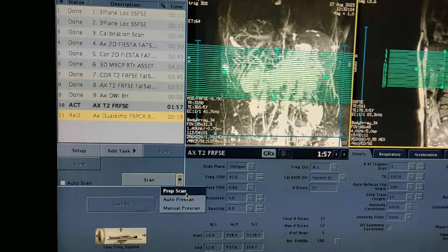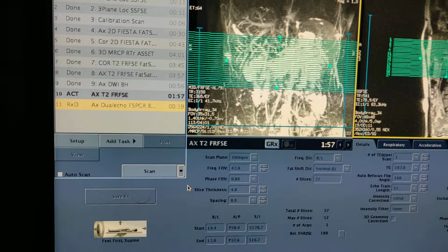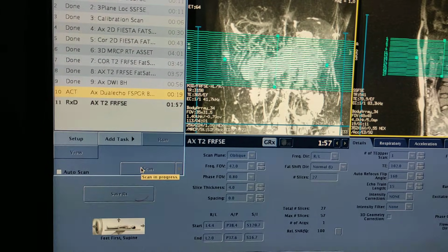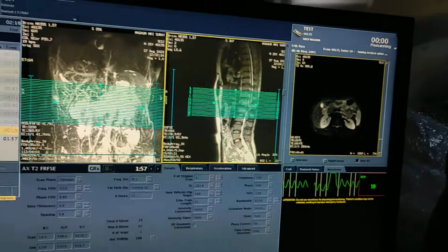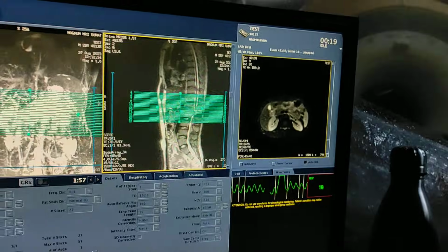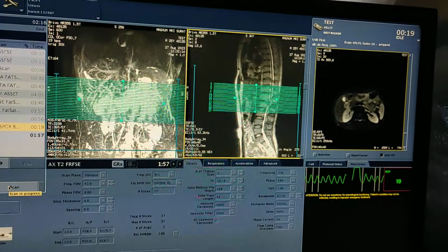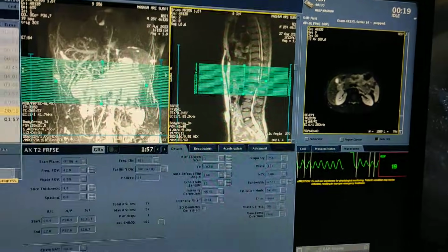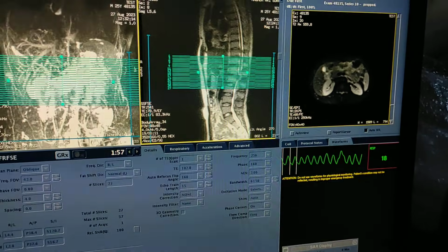Now this is the last sequence. You have to do the prep scan. Click on the prep. Before that, give instruction to the patient. Now you can see this is the prep scan over here. Give instruction to the patient to hold the breath whenever you are advising. Now give instruction to the patient to hold the breath. Hold your breath properly.